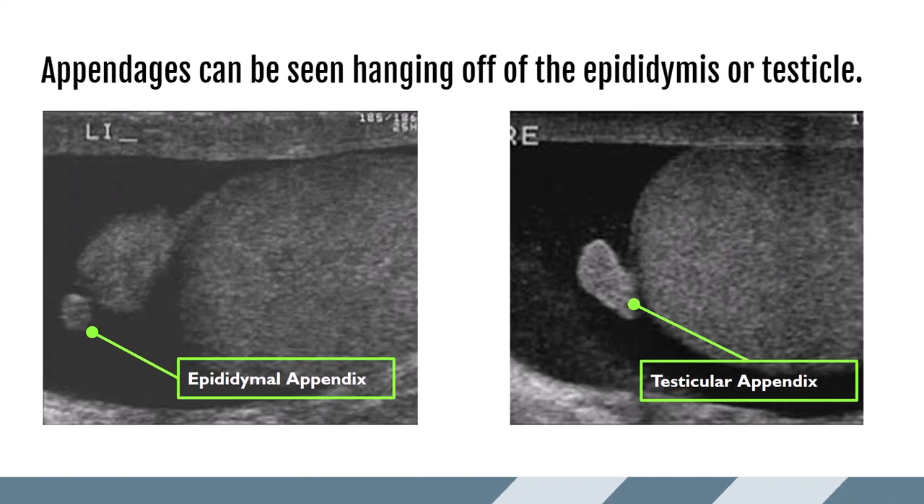Appendages of the epididymis and testicle can be appreciated with ultrasound, usually seen as small soft tissue masses hanging off either structure. On the left we can see a little round structure hanging off the epididymis — that is an epididymal appendix. On the other image, a soft tissue mass hanging off the testicle itself is a testicular appendix. We use color on these to show that they still have blood flow, since these little structures can torse as well — more on that in the torsion lecture. Part of the reason these appendices are seen so well is because of fluid between the tunica vaginalis layers, called a hydrocele, which can highlight structures.